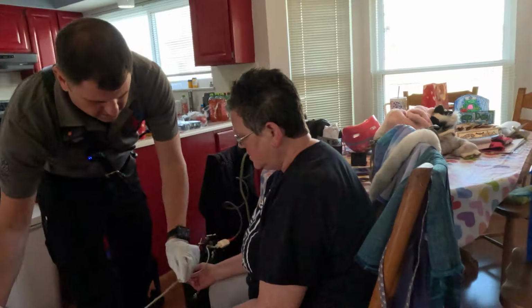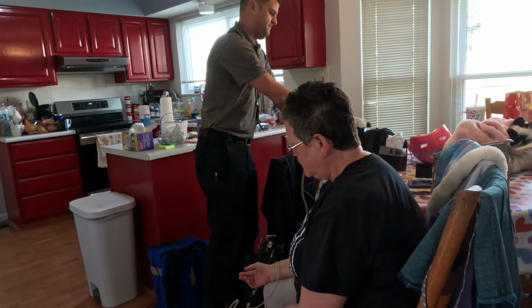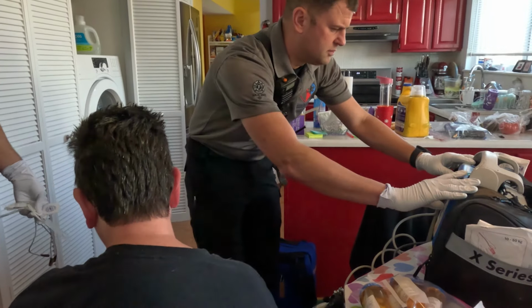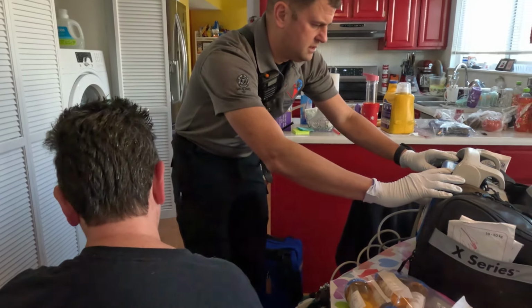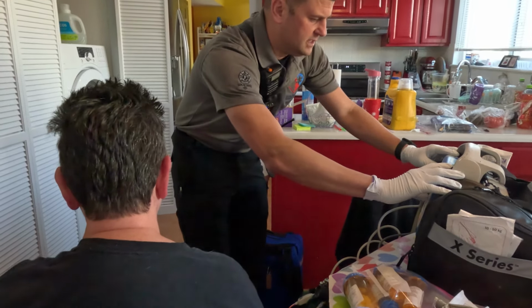So what can we do? We can use a properly sized probe on a site that's clean, that's warm, that's dry, that doesn't have nail polish on it. And we can also look at the underlying pleth wave when that's available to make sure that we have adequate perfusion and a strong signal. And then know the patient's medical history. Considering the pulse ox readings in light of the full clinical picture is going to help you know when it's giving you helpful information or not.